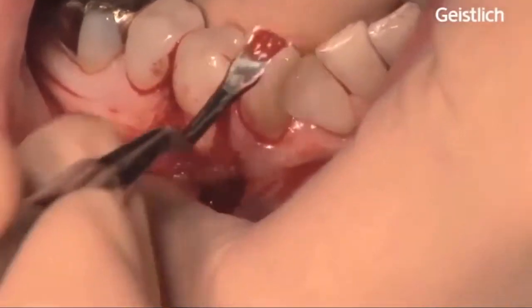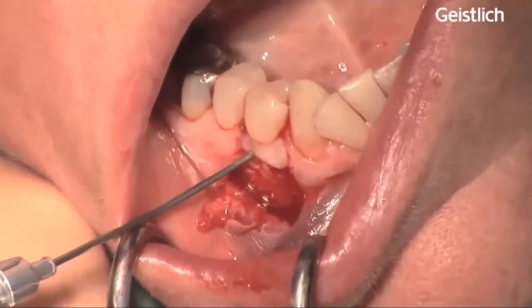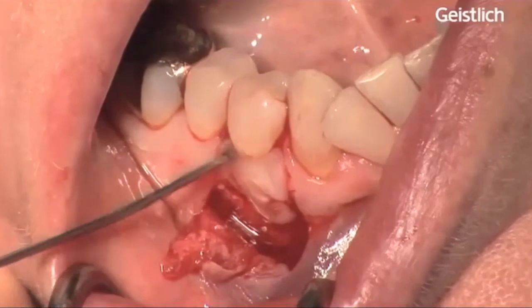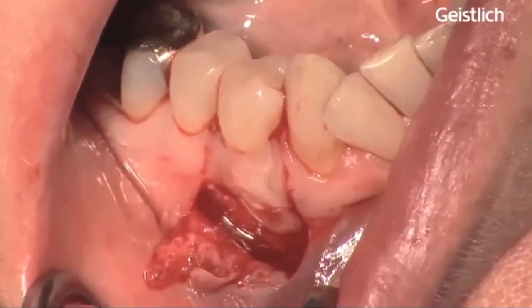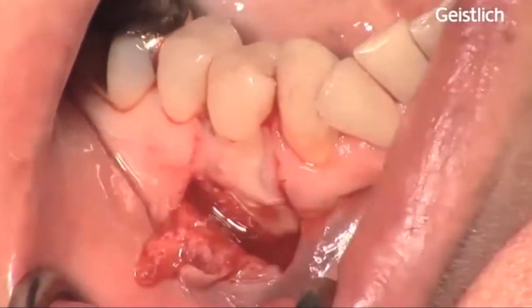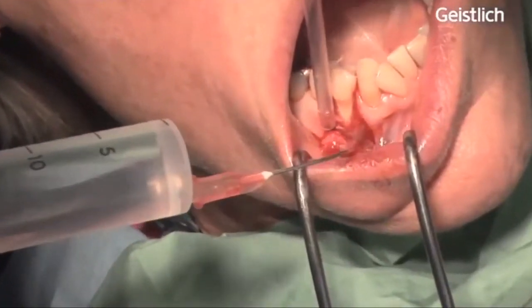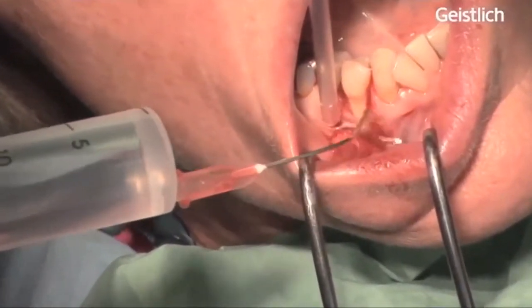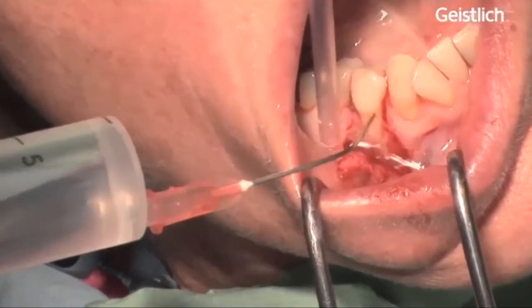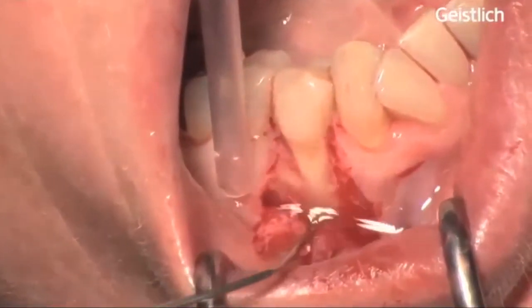The exposed root surface is conditioned with 24% EDTA for 2 minutes to remove the smear layer from the dentine tubuli and to improve coagulum adhesion to the root surface. After EDTA application, the root surface is rinsed with saline for 60 seconds.